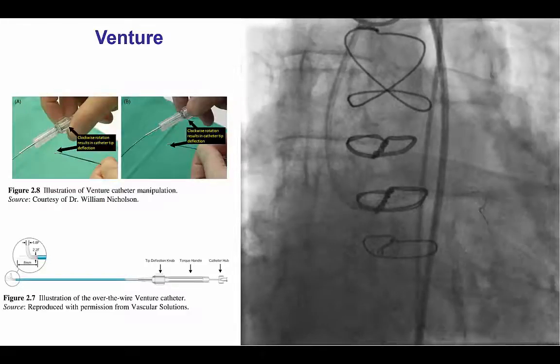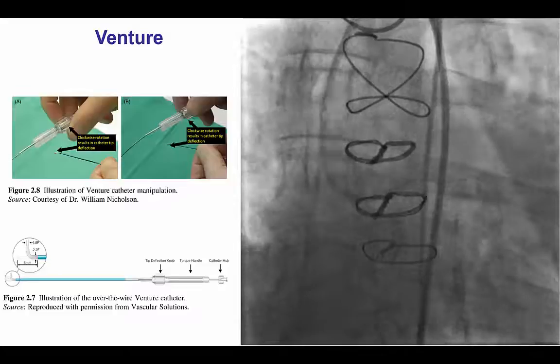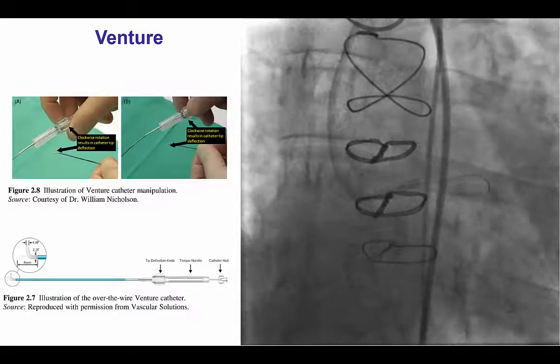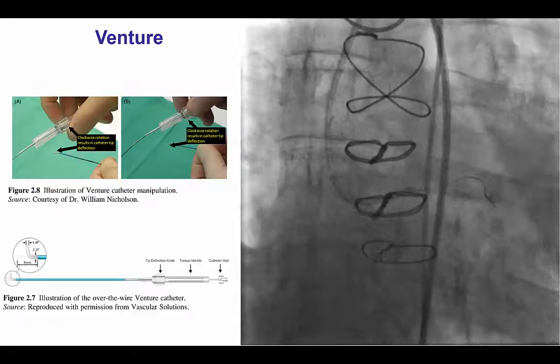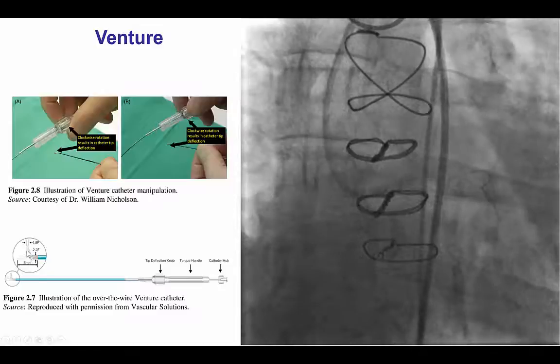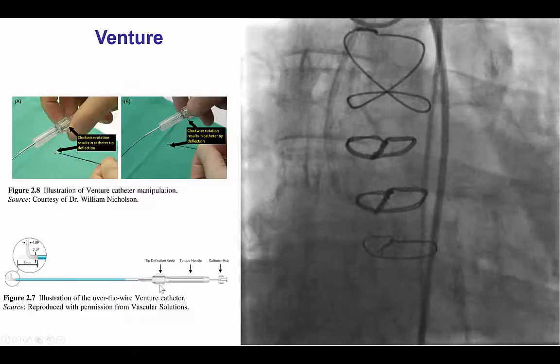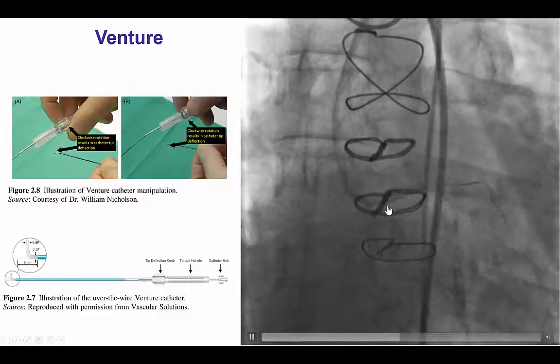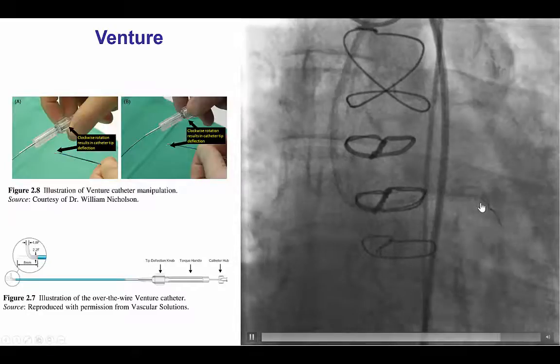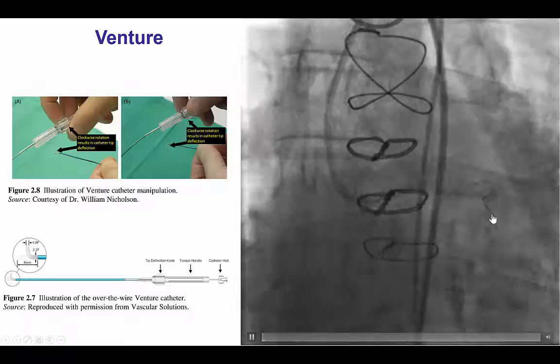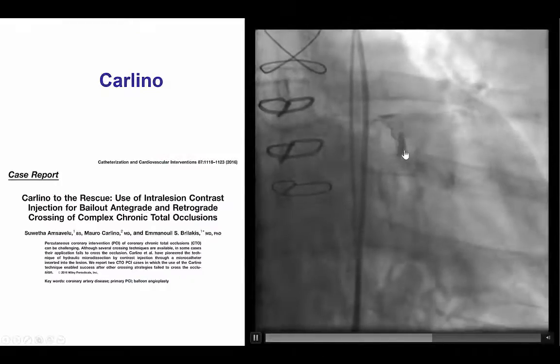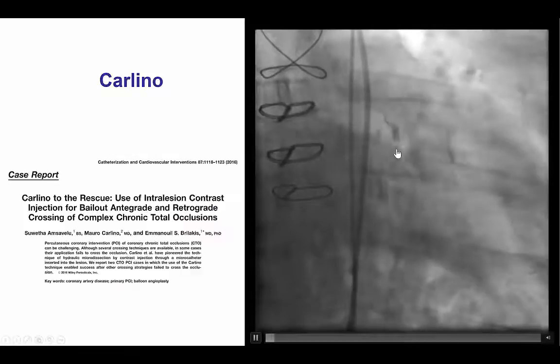We were able to advance through the circumflex, but we had significant difficulty getting wires and equipment through the very tight bend. This is the classic example for using the Venture catheter, which is a microcatheter that has a torqueable tip by turning a proximal deflection knob. We were able to deliver the Venture to the proximal circumflex and use the bend to get extra support, allowing us to advance the guide wire further down. However, we were not able to advance very far into the circumflex.